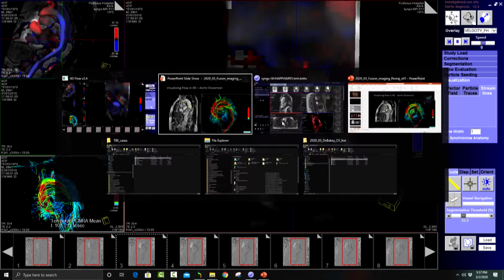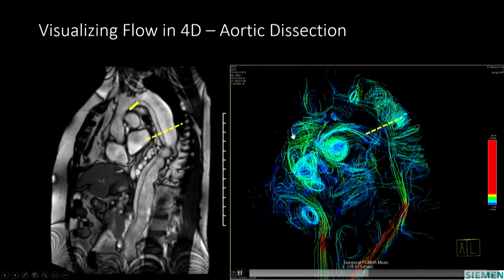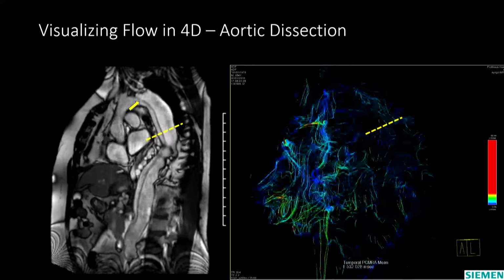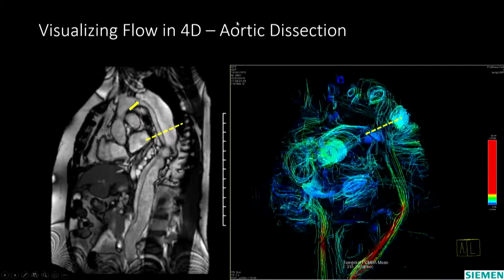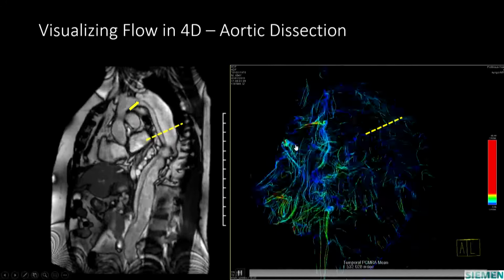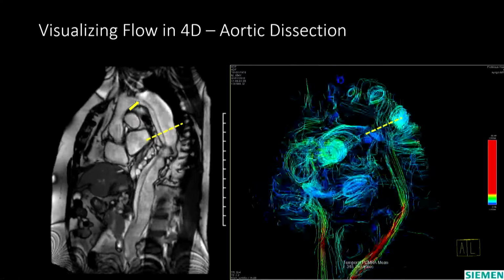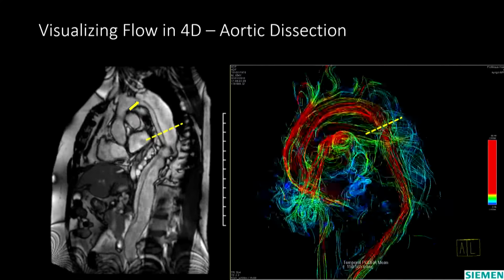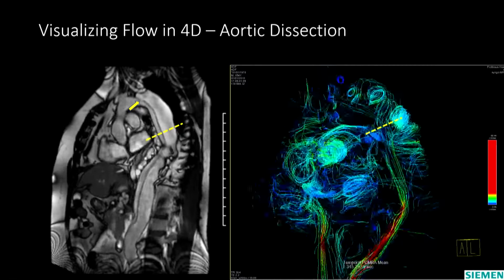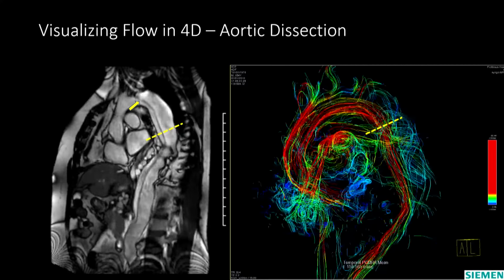I'm not an expert in this, but I see a lot of value in doing this systematically, especially in patients who undergo surgical repair, where there is no metal hardware in them. For example, one of the studies from Northwestern is the helical flow pattern in the ascending aorta. The LV is not just pumping like a mechanical wall, it twists, and that creates a helical flow pattern in the ascending aorta. What happens to that flow pattern if you suture a Dacron graft?